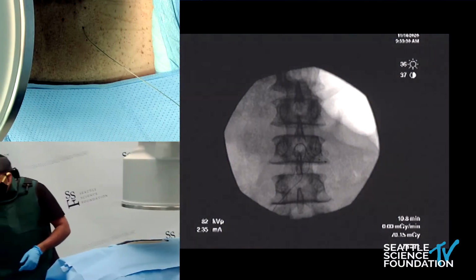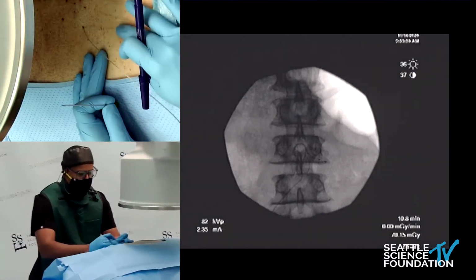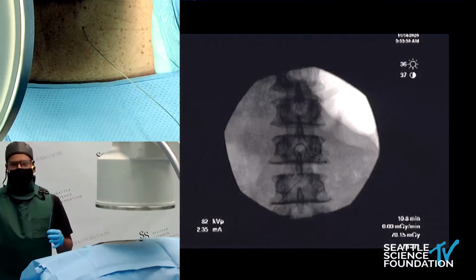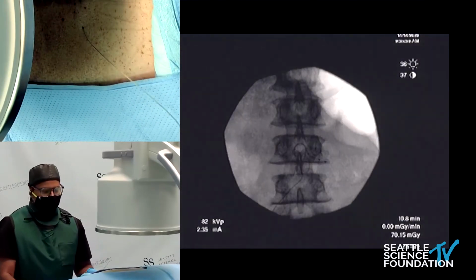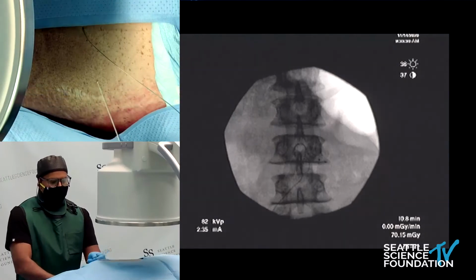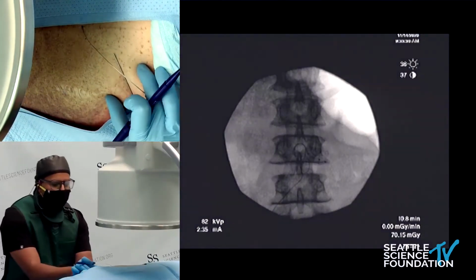So that was a surgeon way back when who figured out that when you oppose skin, you can start to see these horizontal lines. You can Google it yourself, Langer's lines. And if you follow those lines, you'll tend to see a better cosmetic appearance for incisions. So I'll just move out a little bit lateral here, and I'm just looking at those Langer's lines.